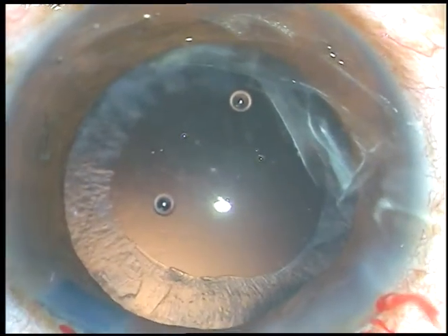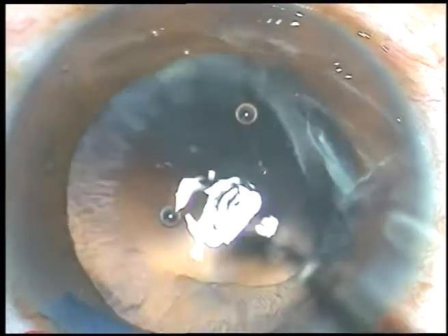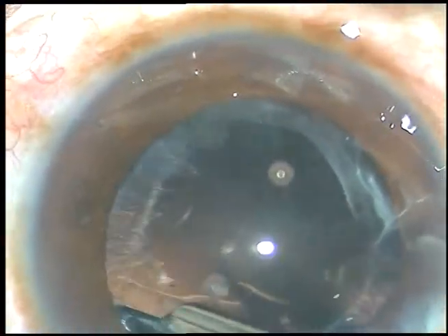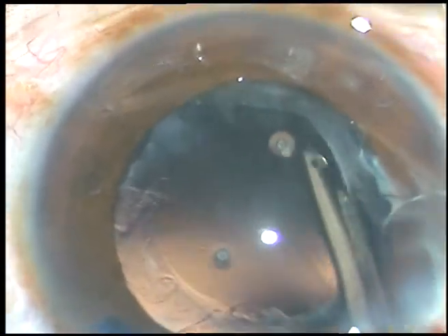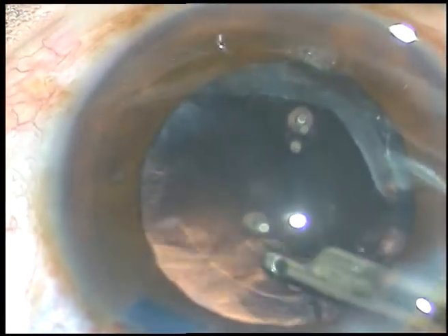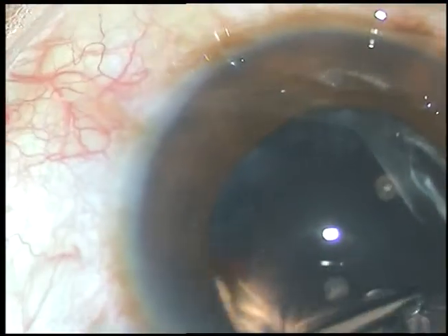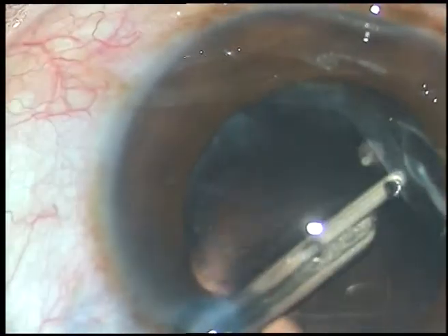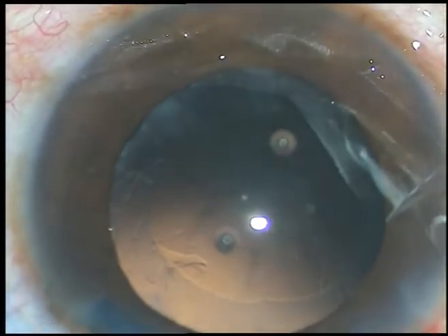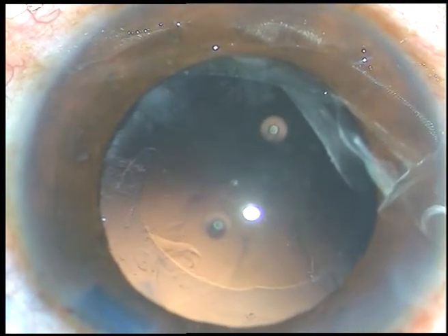Viscoelastic substance is injected again. Now cortical cleanup is to be done. I am using a 23 gauge Simcoe cannula to clean the cortical matter. The sub-incisional cortex is being removed, introducing the Simcoe cannula through the side port. This is a very slender 23 gauge Simcoe cannula.